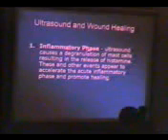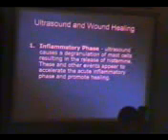Duty cycles less than 100% are usually termed pulse ultrasound, while a 100% duty cycle is referred to as continuous ultrasound. How does ultrasound benefit wound healing? In the inflammatory phase, ultrasound causes a degranulation of the mast cells, resulting in the release of histamine.